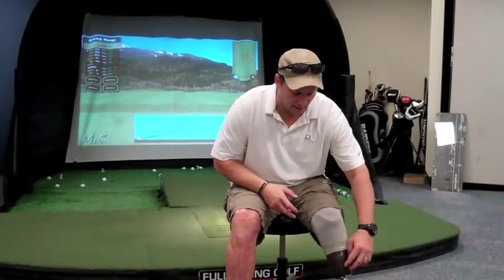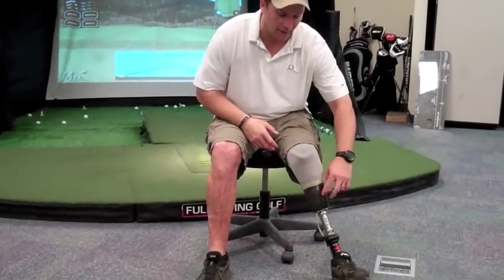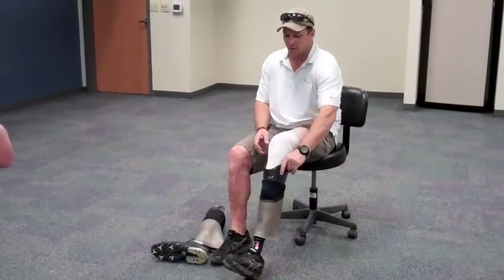Every time the same thing would happen — it would open right here and then over time continually get a little bigger. I'd have to come out of the leg for a couple, maybe two or three months, let it heal, and start over again.